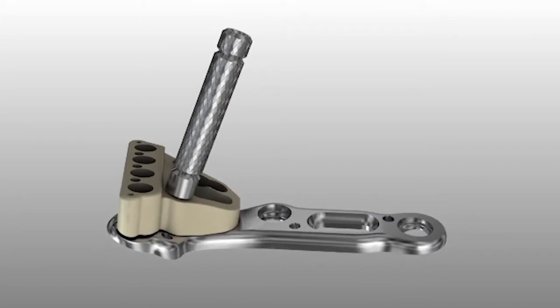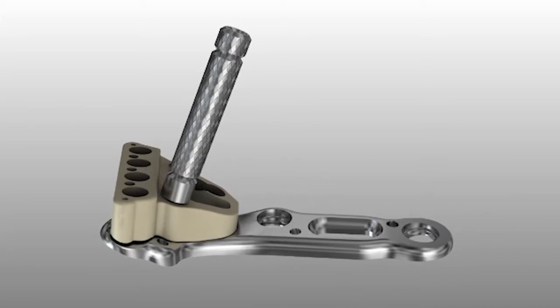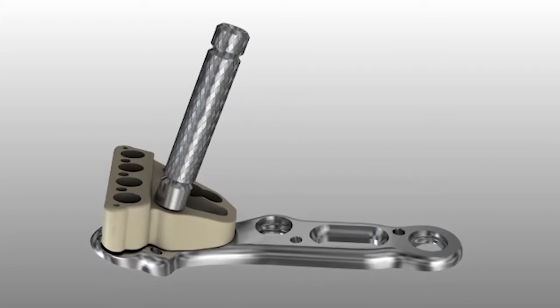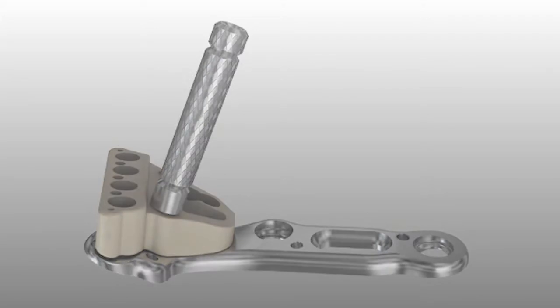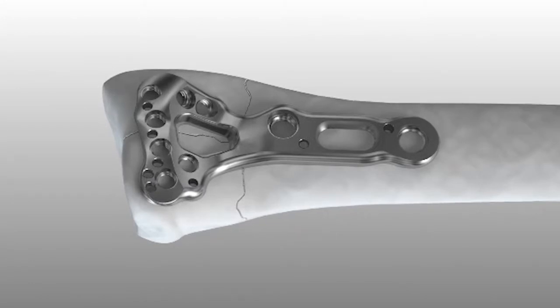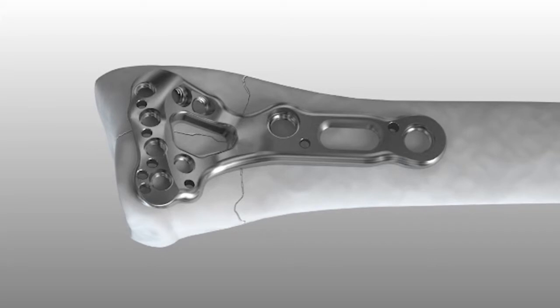The locking bolt can be inserted into multiple distal screw holes through the targeting guide. It is recommended to utilize the proximal ulnar screw hole, as that is typically an optional hole for screw placement. This may be done on the back table prior to insertion. The proximal shaft of the chosen plate should be placed parallel to the radial shaft. The plate is designed to sit along the distal aspect of the radius to support the volar articular fracture fragments.